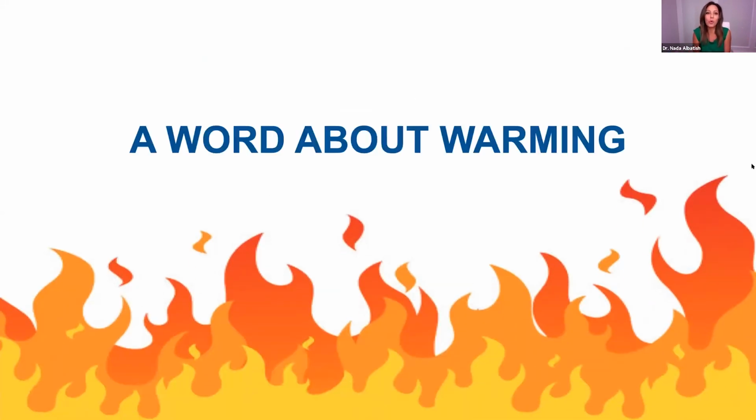Okay, so I'm going to take a moment and talk to you about warming your composites. There are studies that talk about warming composites and what the effect is on the composite itself. Because you guys are clinicians, but you started as scientists, and as a scientist, you want to know what's happening to the materials that you're using. There are studies that show a range of things. Studies that show that when you warm your composites, it actually improves their physical properties. And there are studies that show when you warm your composites, it causes no change to the physical properties of the composite.